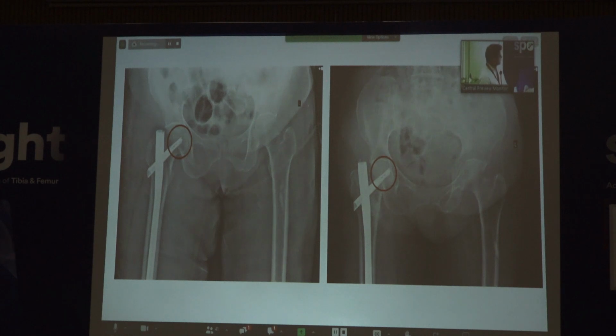So I think this is the cut through that is, I think, what typically happens in the TFNA, rather than with the other implants like the Synthes or the Gamma nails or the Zimmer ones. They mostly go to the cutout rather than the cut through. I think this is a typical cut through problem that the TFNA has. It's uncommon, occurring in less than 2% or 3% of all cases. And most of the cases that we see in Japan are cut through rather than cut out.